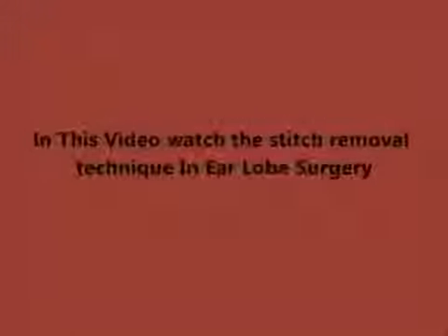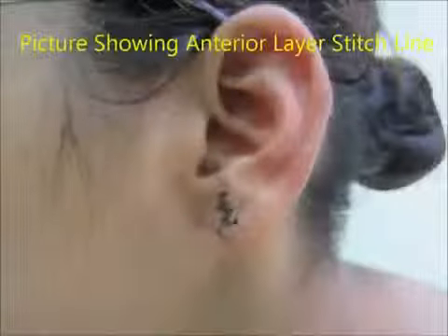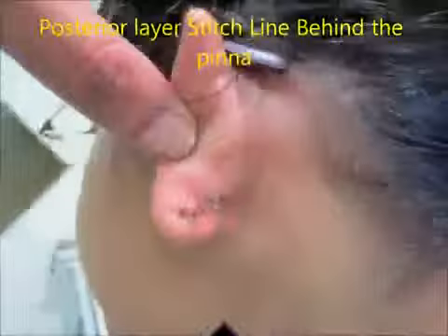Friends, here is a 12-year-old female with implantation dermoid in her left ear lobe, which was removed and suturing done. You can see the stitch line on both the anterior and posterior surface. In the posterior surface the stitch line is bigger, as the implantation dermoid was on the posterior surface.